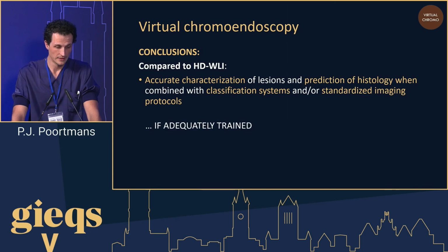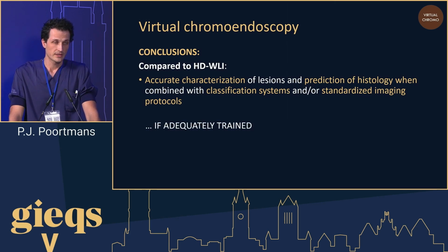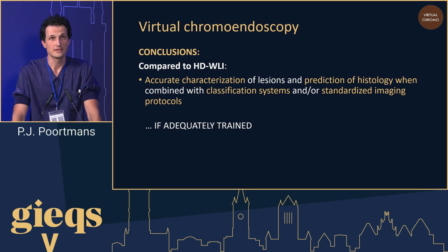So to conclude, to compare it to white light, we can perform accurate characterization of lesions and prediction of histology when you combine it with classification systems and/or a standardized imaging protocol, if you are adequately trained to use it.